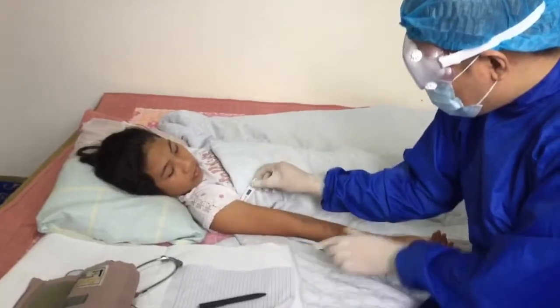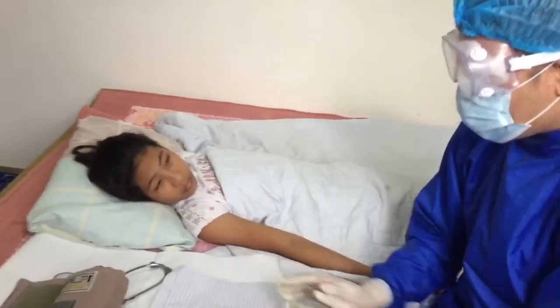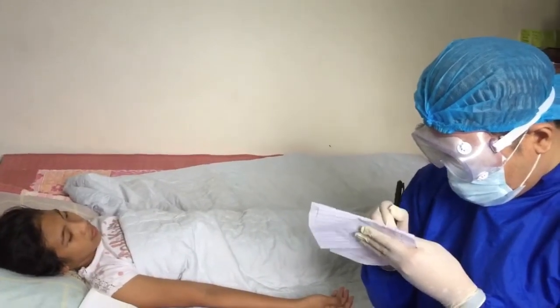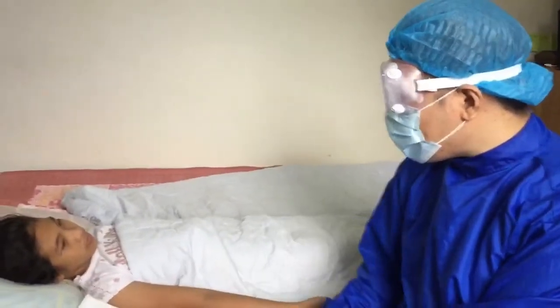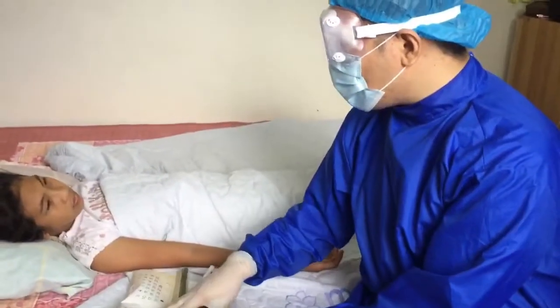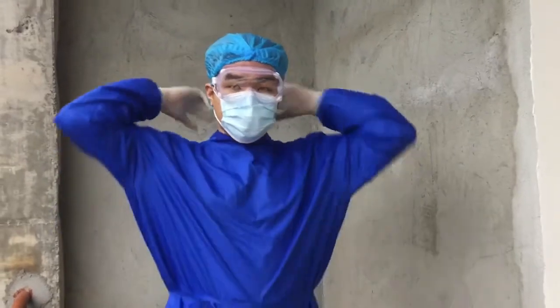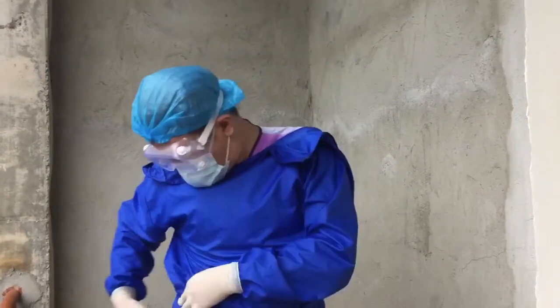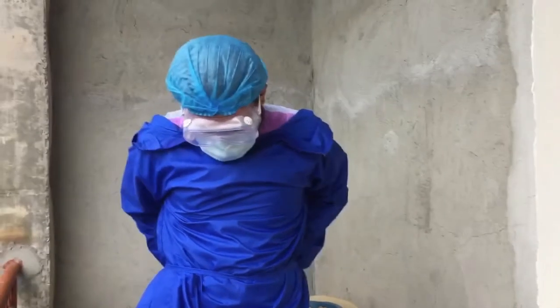For BP taking, put the cuff on the client's left arm and place the stethoscope on top of the client's gown, then put the BP cuff on top of the patient's gown. And leave the client comfortably. This is to facilitate ease of mind and help reduce stress and help her recuperate. When patient care is completed, untie the waist string of the gown first, then remove gloves and drop them in the appropriate container.